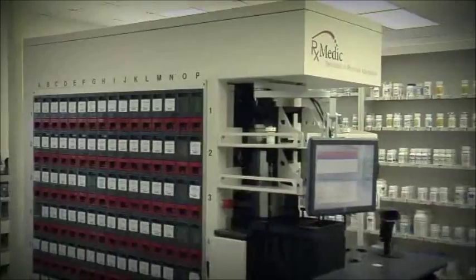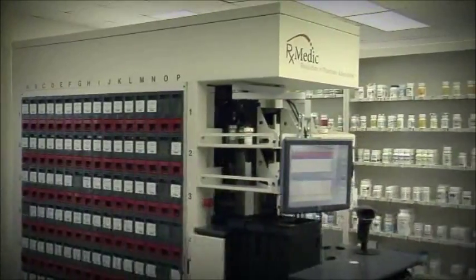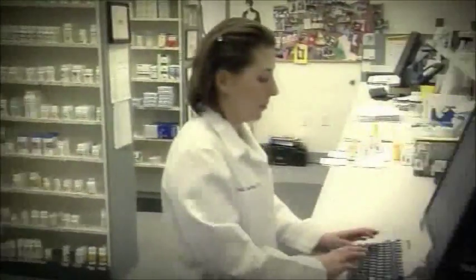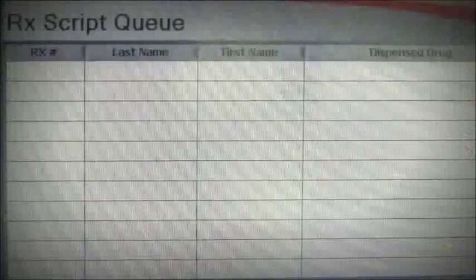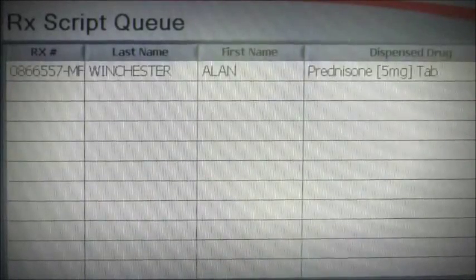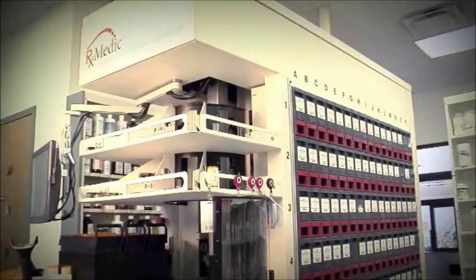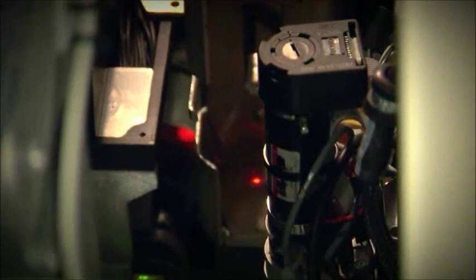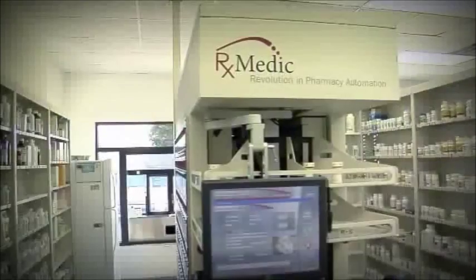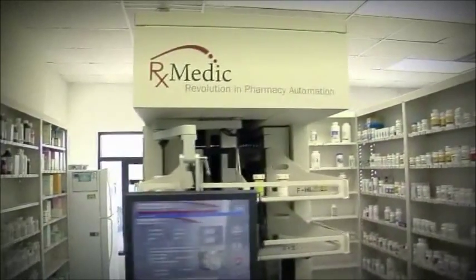As scripts are received electronically by the RxMedic ADS, they will appear in the script queue and the ADS will begin the order preparation process. First, the appropriate size vial is selected and labeled. The vial is carried to the appropriate VIN location where the medication NDC number is verified using barcode technology.